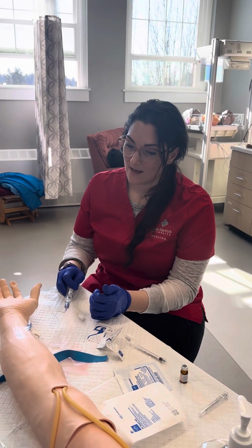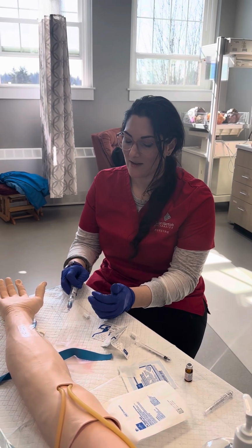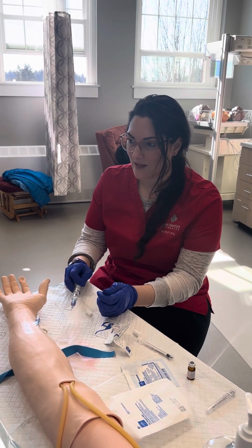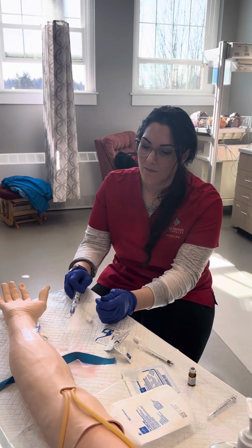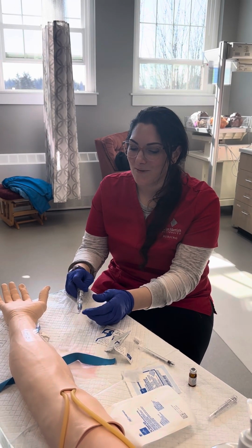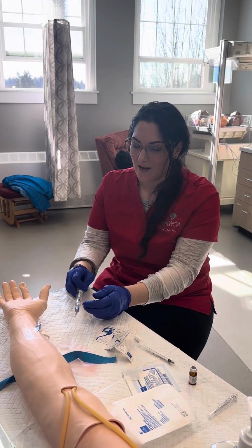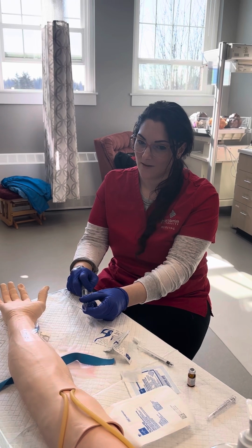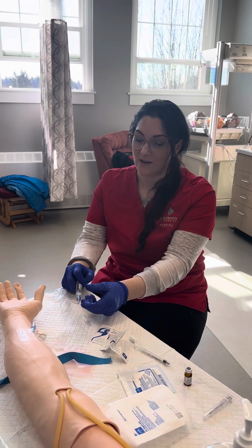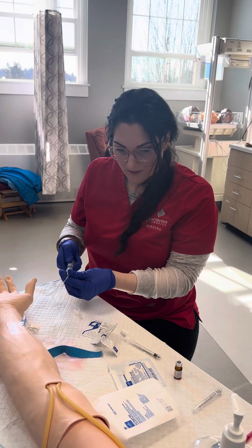I would document the catheter size, the pain medication I used, the date, time, how he tolerated, the fluid I used to flush, the blood return, the response from the patient, all that fun stuff. I would also document that I assessed the catheter size, and also that I provided him the teaching. Okay, I did this for 3 minutes.